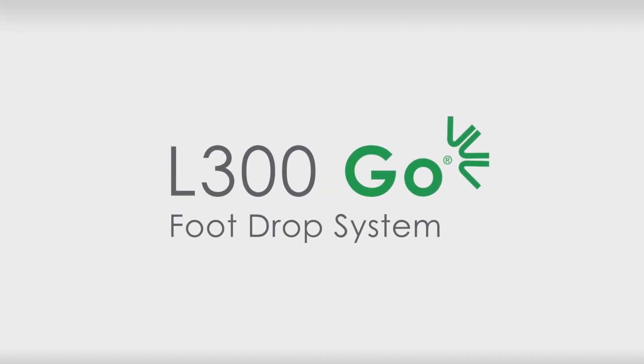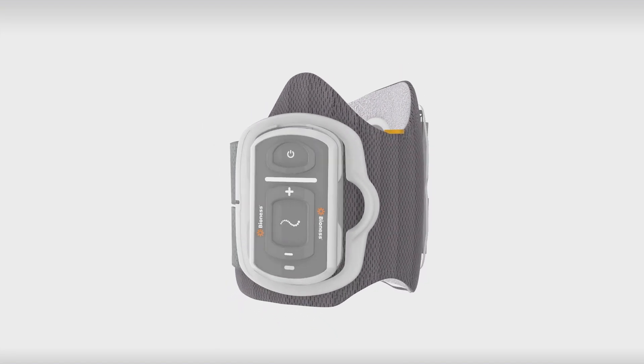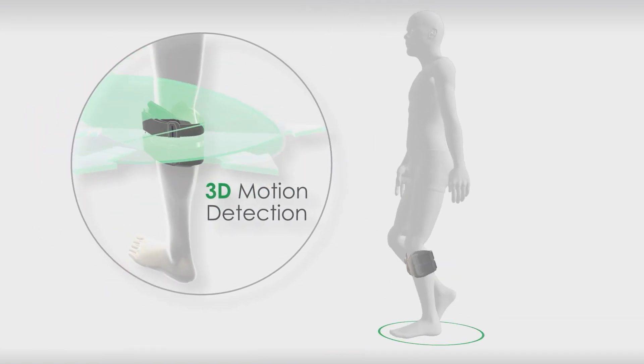The L300GO is specifically designed to meet clinician and home user needs through innovative product features and expanded configurations. Using an adaptive learning algorithm, the L300GO detects gait events, providing stimulation precisely when needed.